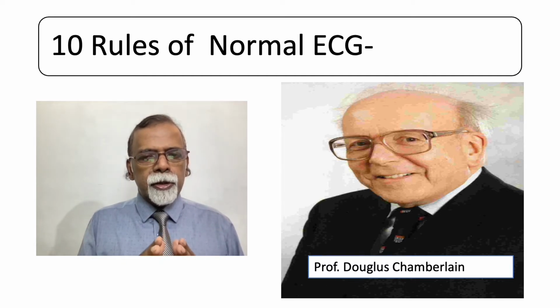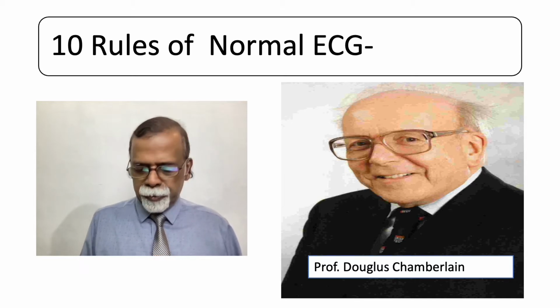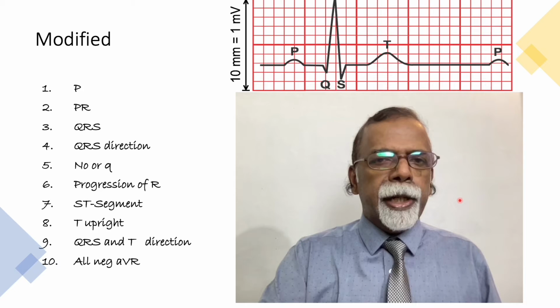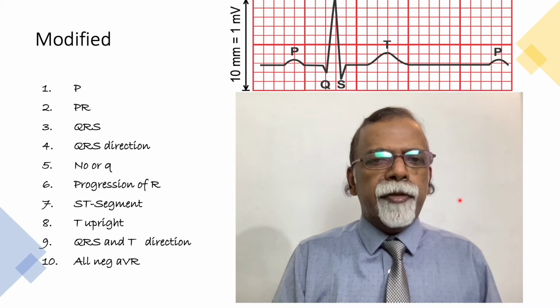This does not identify what is the abnormality. That is a point to be remembered. This can be used by anybody who has got interest in electrocardiogram. Minor modification has been made in the rule so that you can easily apply this in everyday practice.